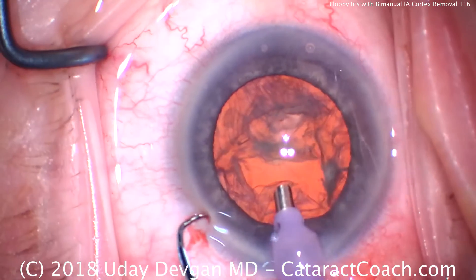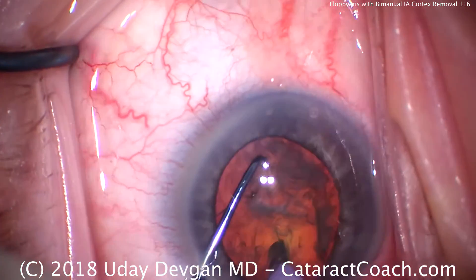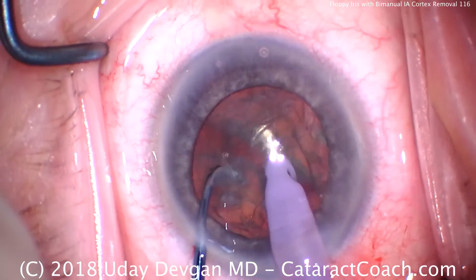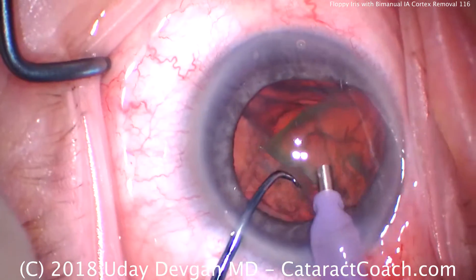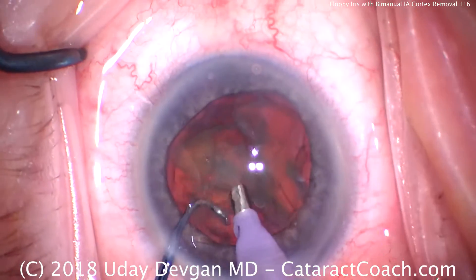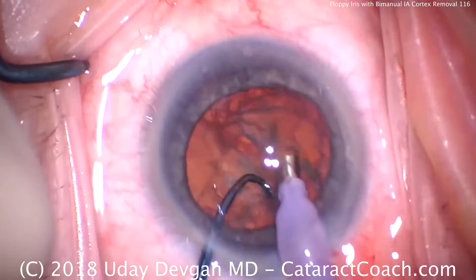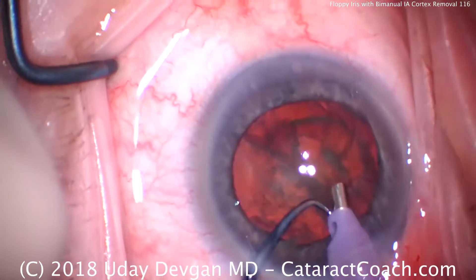We're going to dig in with the chopper and also buzz in with the phaco probe at the same time, and split this nucleus into two halves. Each half can now be brought up. Notice how I use the chopper with the left hand to keep one half down and move it out of the way while I bring up the other half, then we just sub-chop it. Here's a little piece taken off the first half. The rest of the first half of the nucleus is brought up and emulsified with the phaco probe.